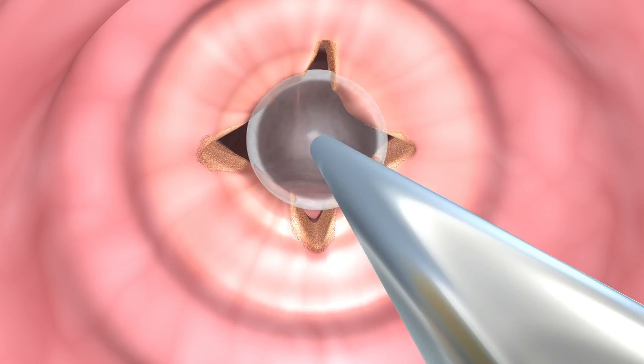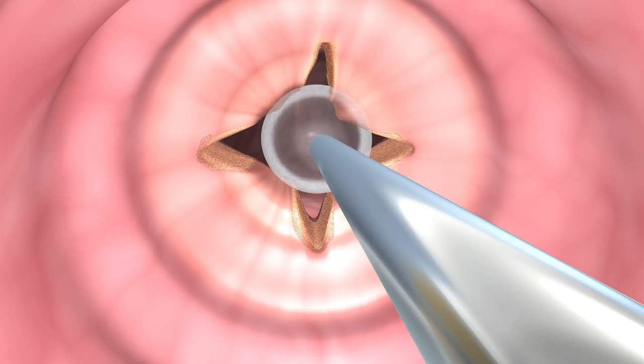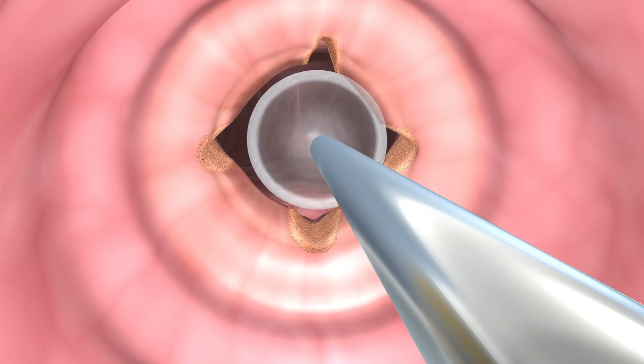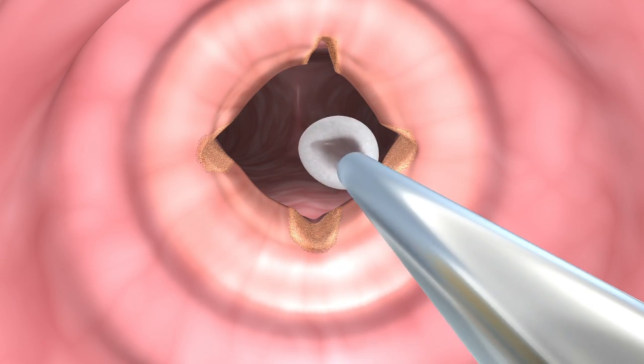Reapply pressure 2 or 3 times to allow the stenosis to dilate at the point of where those incisions were made. Most of us are using mitomycin C to try to decrease fibroblast regrowth and rescarring. Wash the residual mitomycin C away from the wound with a saline or a xylocaine wash.